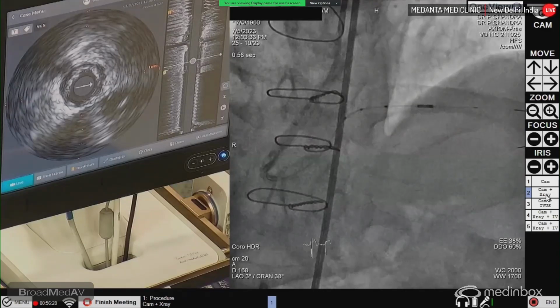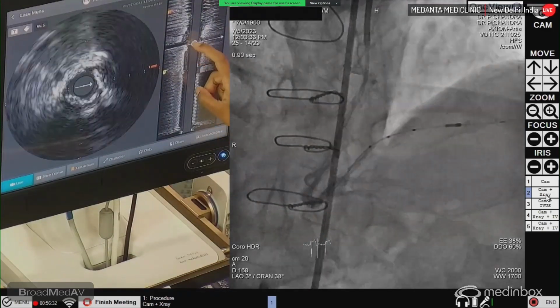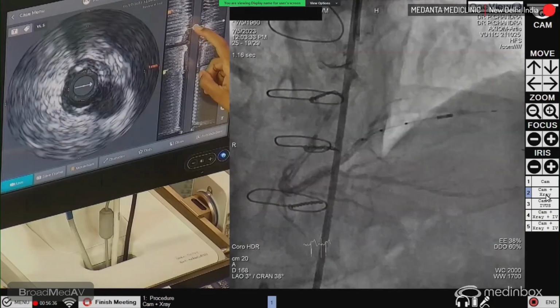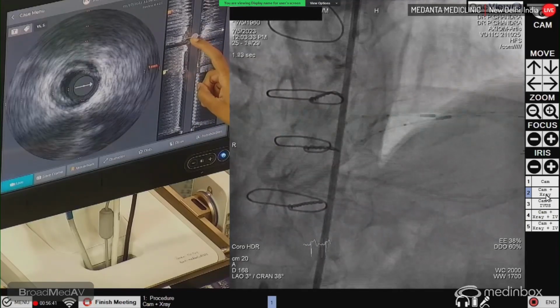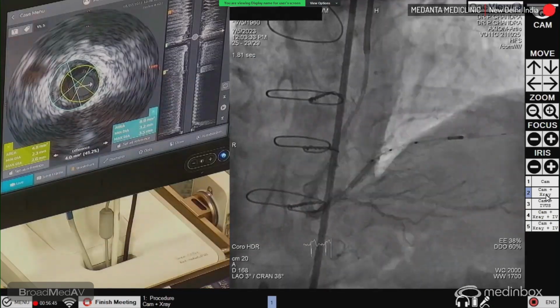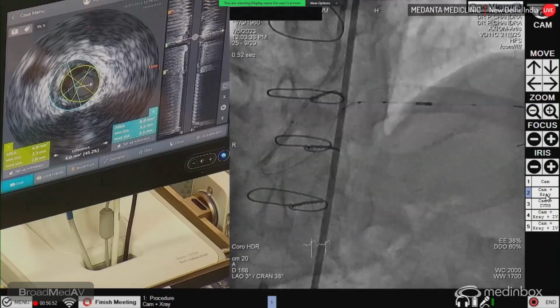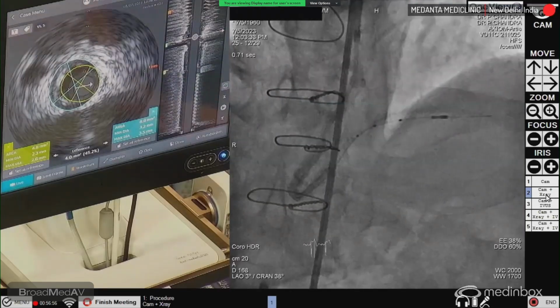what is the distal vessel size? 2.5 or 2.75? On IVUS, let me know. Distal. Go distal. Okay. This can take a 2.75. Yes. And this is what, 44? No, that's too long. Give me a 2.5, 40. This one. You can give me a Cruise.